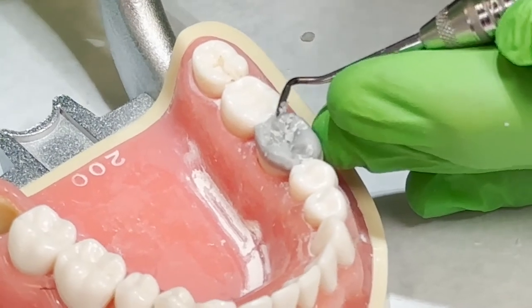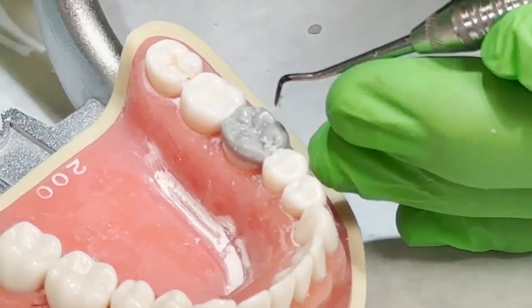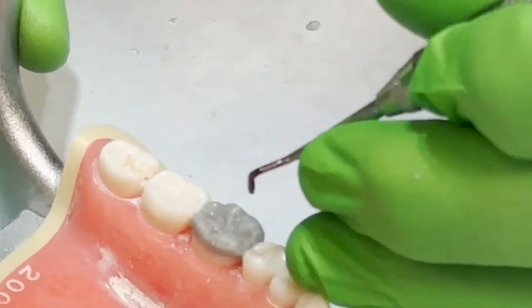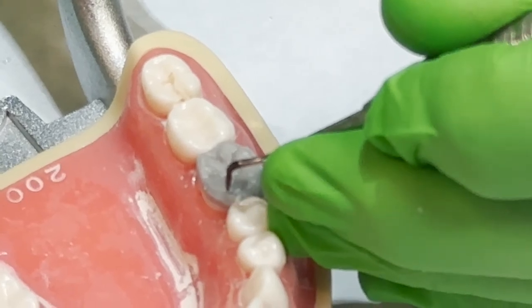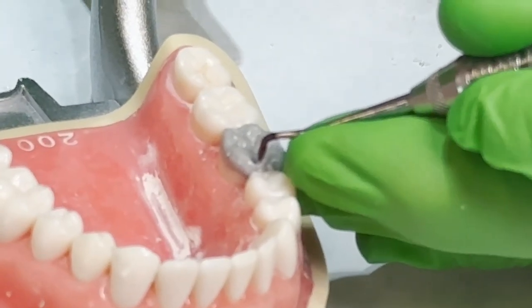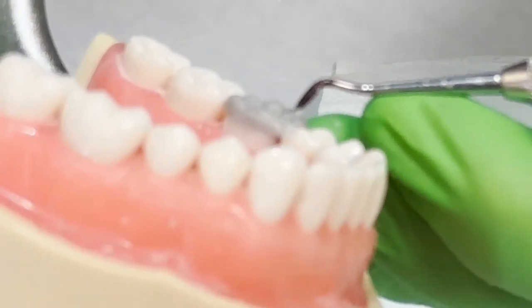Incorporate all of the things we talked about on this tooth. Which cusps are larger, which grooves go where. And I think I'm pretty close to where I want to be. Well, we ought to have some interesting wax-ups. Yeah, I think I'm gonna polish and... Yeah, that looks like a molar. Polish and call it.